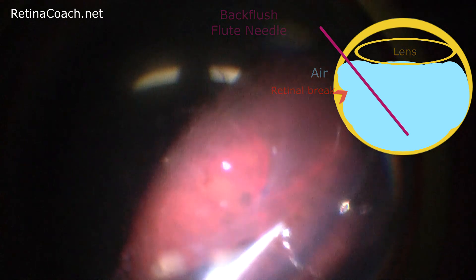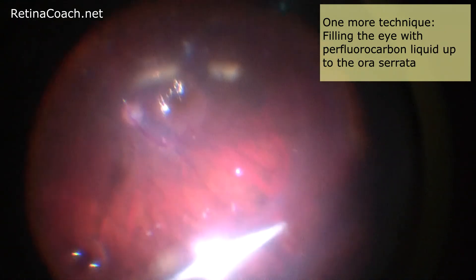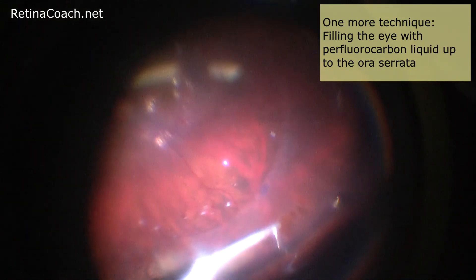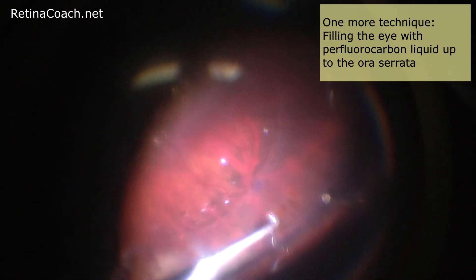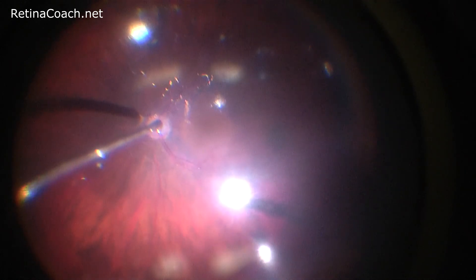One more technique to re-attach the retina — not shown in this video — is filling the eye with perfluorocarbon liquid up to the ora serrata. In contrast to the previous techniques, the laser is performed under perfluorocarbon liquid, which facilitates visualization of the retina. Before injecting the perfluorocarbon, it is essential to remove any traction over the retinal break that can resist retinal flattening.